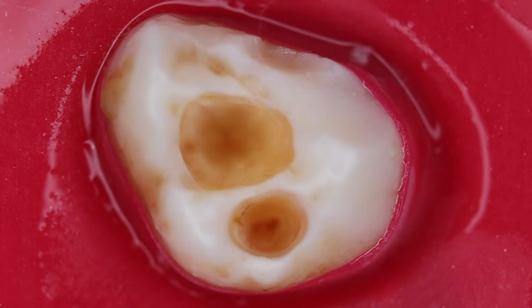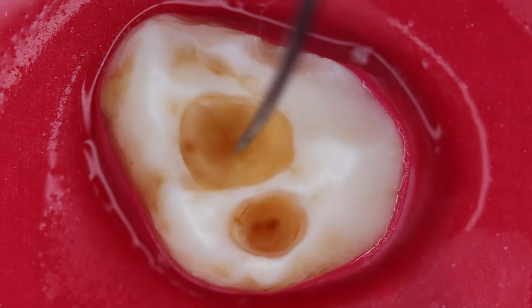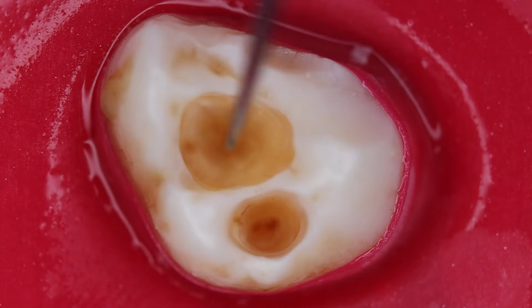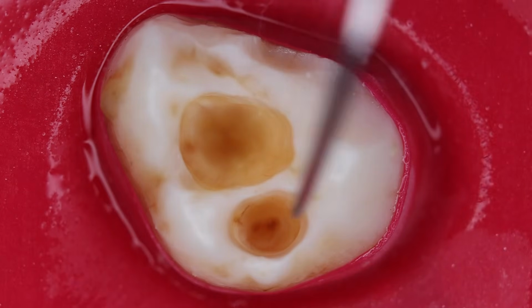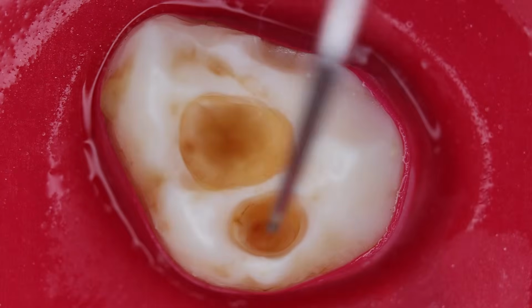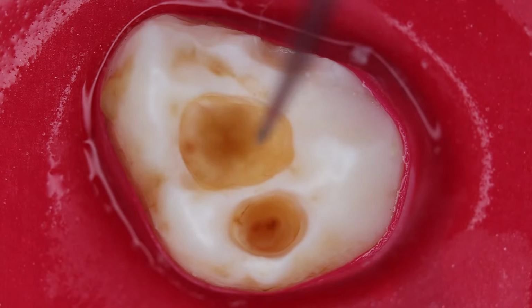Now we are onto the roof of the pulp chamber. This is the roof of the pulp chamber, this darker area, and once we get a drop, then we would enter the pulp chamber. We have removed almost all the caries that was there on the occlusal aspect.